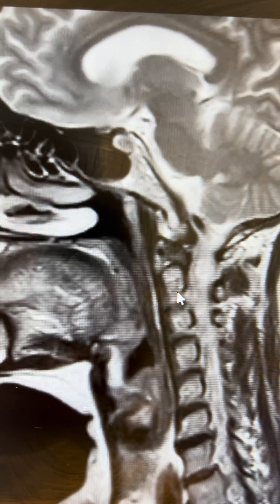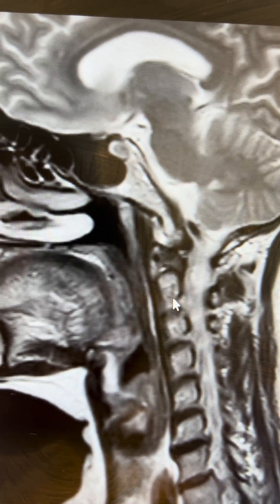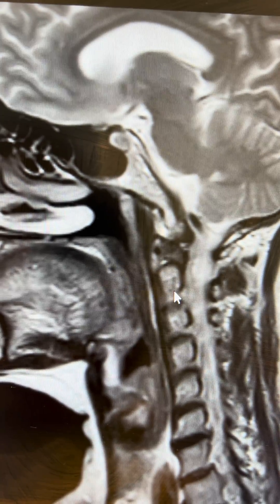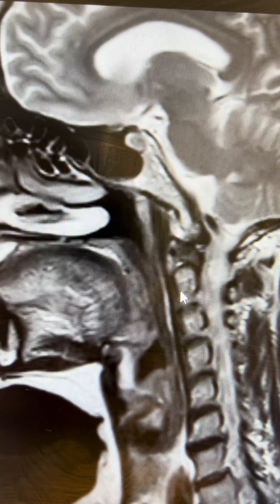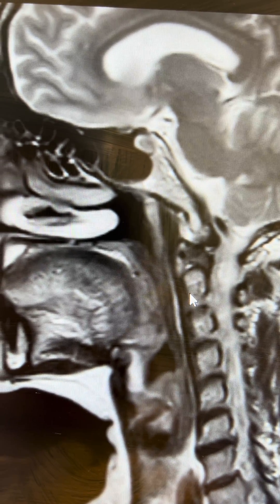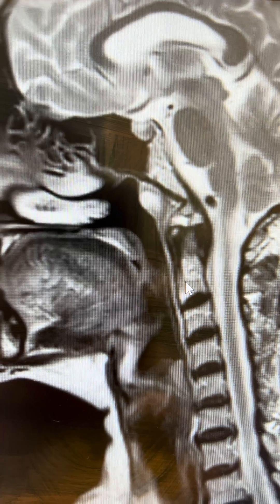This is an MRI scan, T2 weighted sagittal section. The patient presented with blocked nose on and off.